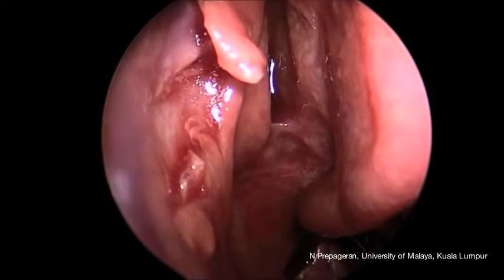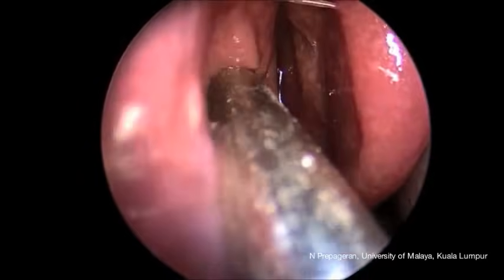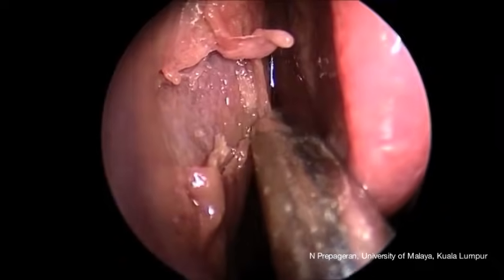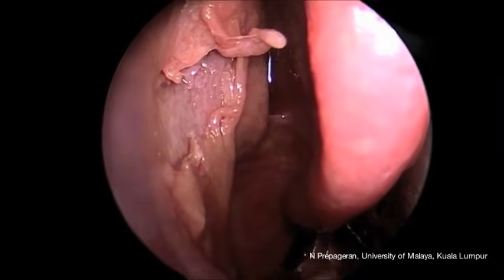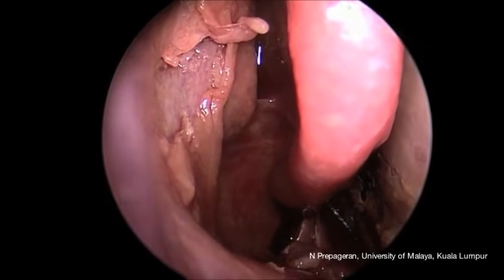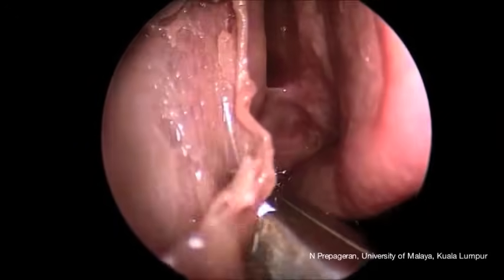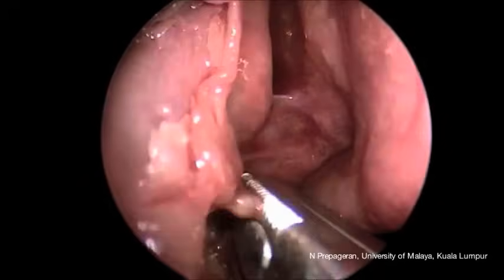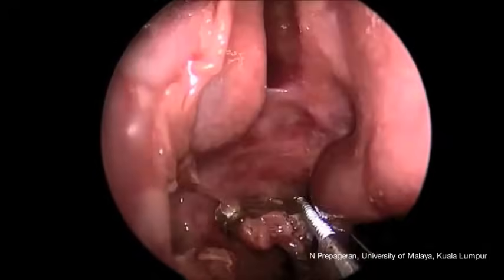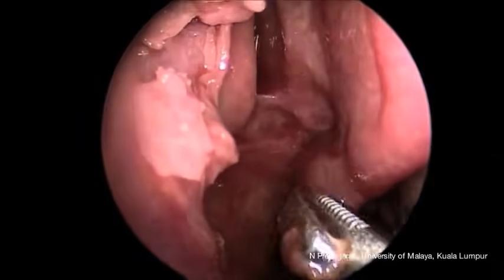Now let's see whether we can remove only the bone of the uncinate process. You can appreciate how the blind sac is covered by the mucosa of the uncinate process there. That is the blind sac — like a blind sinus formed posteriorly — with the uncinate bone in between in the shape of a boomerang. Then you can actually do a retrograde uncinectomy by using a backbiter.